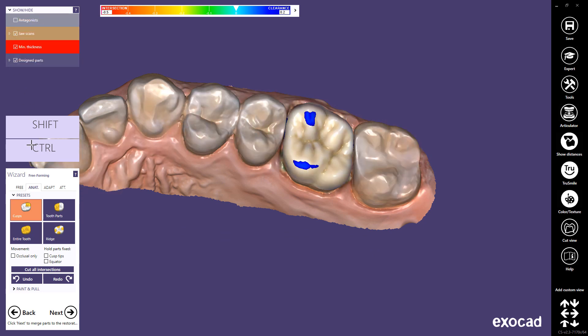If you prefer to adjust all adaptations manually, use Undo. The colour reference bar on the Show Distances window shows the colours used in the distance visualisation, and emphasises where there are intersections and where there is clearance between the selected objects.